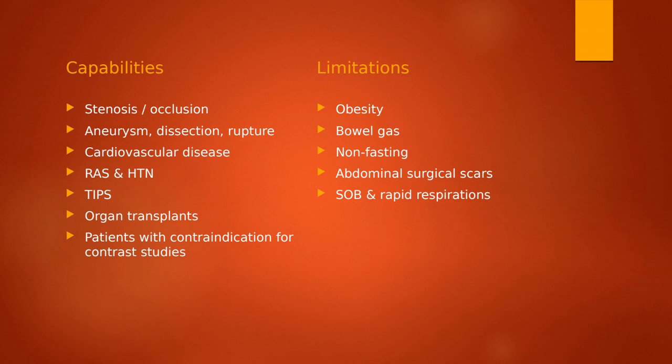Of course, with anything in the arterial world or the vascular world, again, like our peripheral evaluation, we have capabilities and limitations. Very, very similar to what we just talked about on the previous lecture, but there are some additional things in terms of what we're able to evaluate within the abdominal cavity.